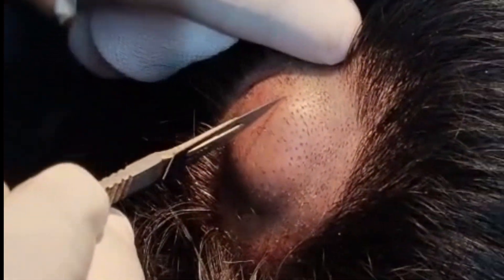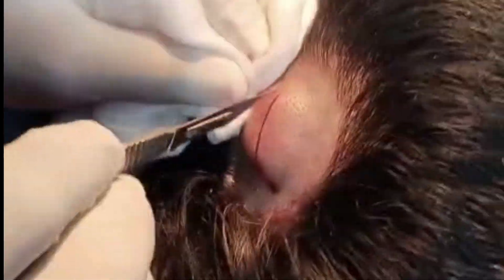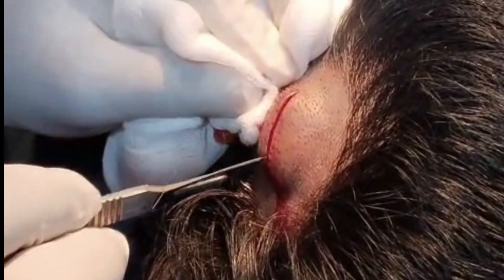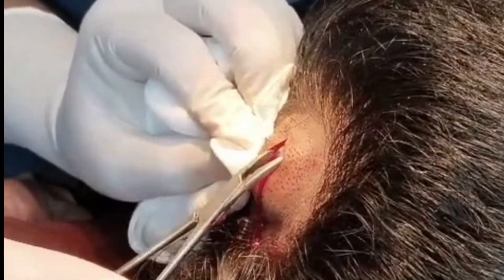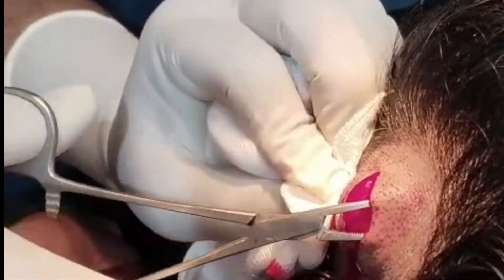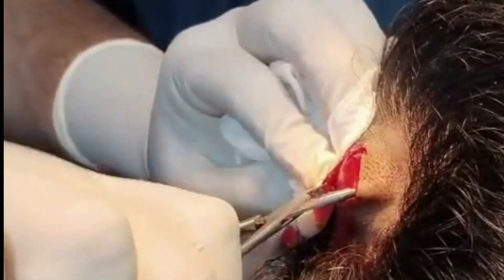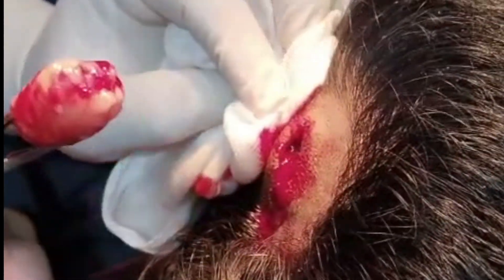A small linear incision is made directly over the cyst to access it without rupturing. Using rat forceps, I carefully assess the location and depth of the pilar cyst to ensure precise dissection. The cyst was carefully dissected and removed intact, minimizing the risk of rupture.